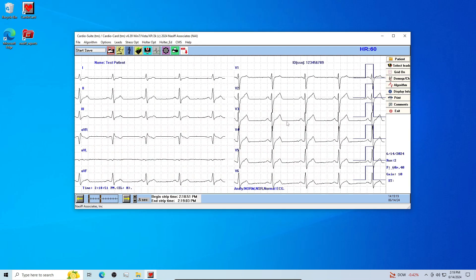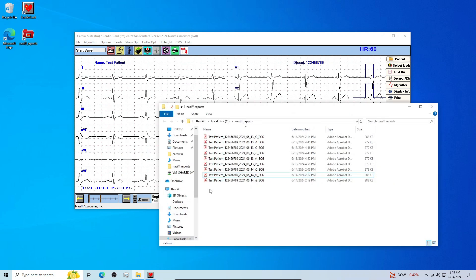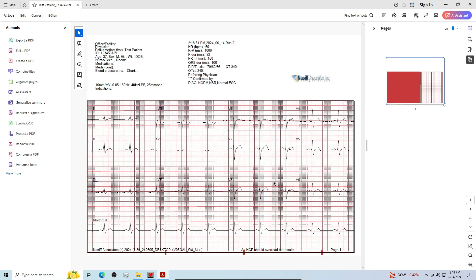View digital tests in the desktop reports folder. From here, you can easily view the digital ECG report documents. Let's open the ECG test report we just recorded. This report can be shared for over-reading or automatically sent to your center's EMR system.